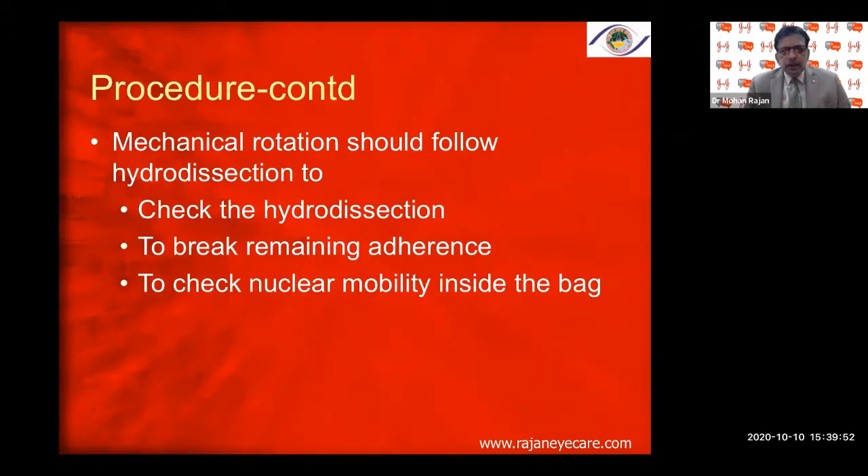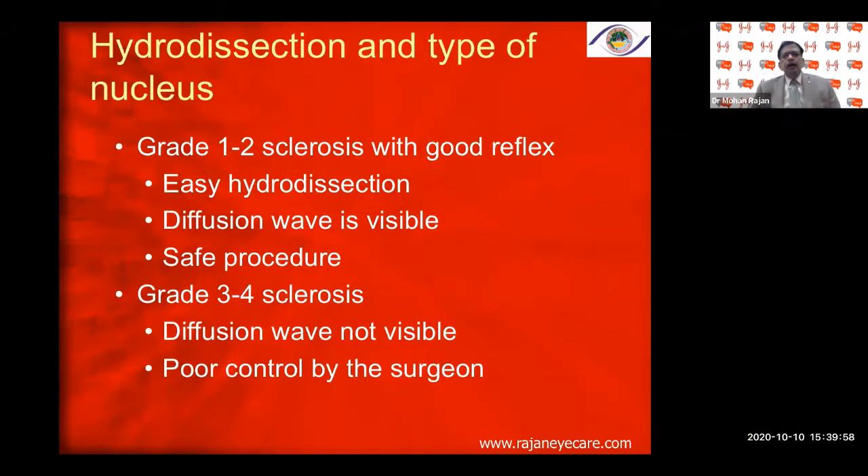In Grade 1–2 sclerosis with good red reflex, easy hydrodissection — a diffusion wave is visible across the posterior capsule. In a really dense, white, or brown cataract, you will not see the posterior capsule clearly, so the defusion wave is not visible. You must look for other signs of good hydrodissection: forward movement of the nucleus, shallowing of the chamber, and nuclear rotation.